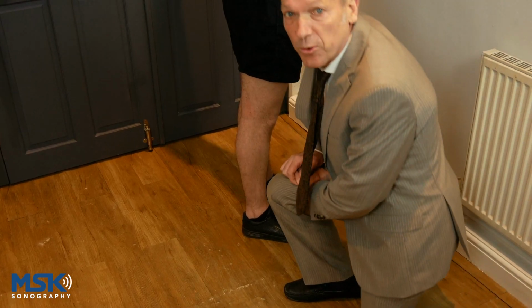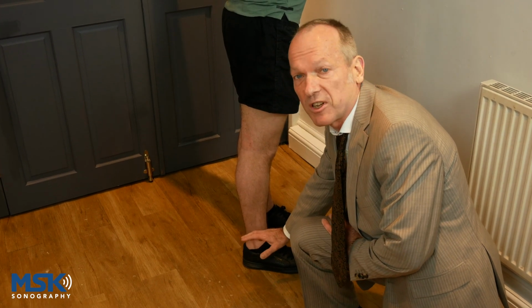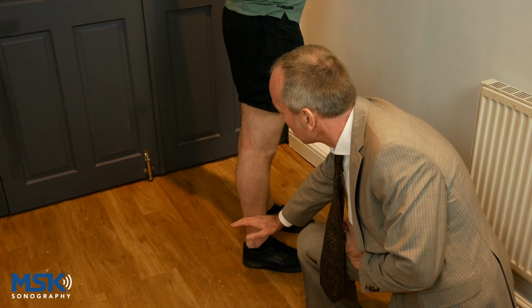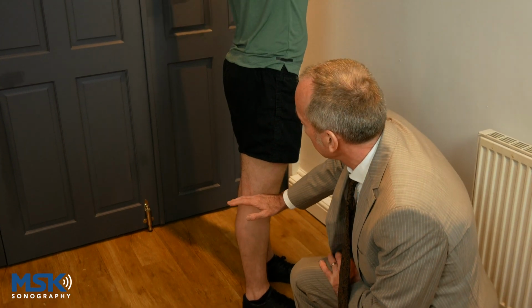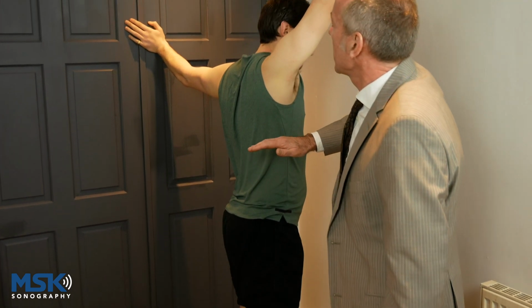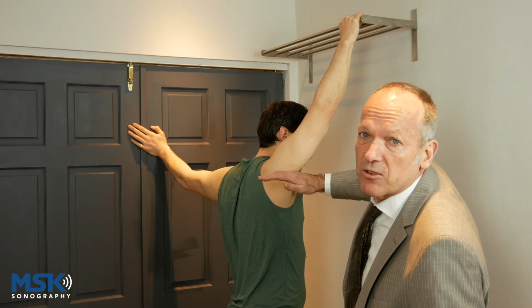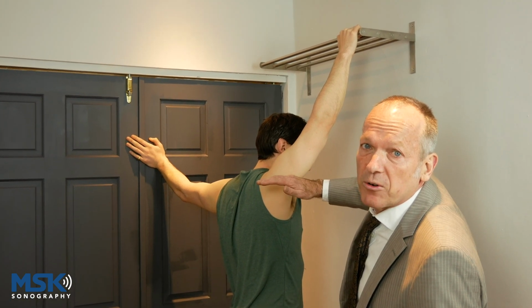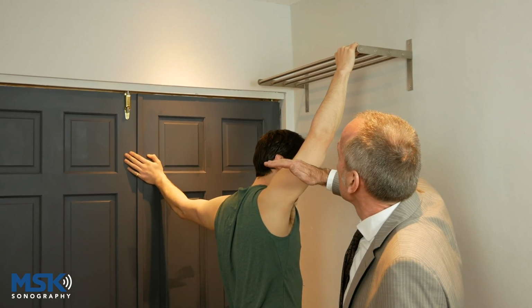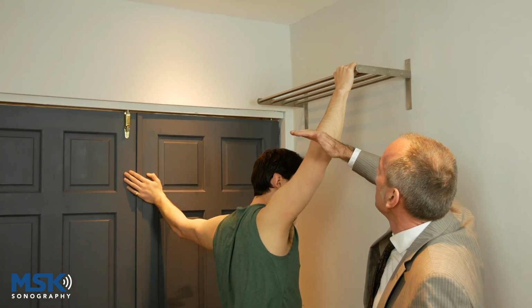So when I'm scanning this region, with the foot representing the distal aspect of the central sagittal aponeurosis 2/3 of the way down the thigh, keeping it in short axis, we move the transducer up, keeping this aponeurosis in the middle. As we come up to this area here where the indirect tendon is coursing deep and laterally, we encounter a posterior acoustic shadow. And then we keep going up, following the direct head first to understand the lie of the land.